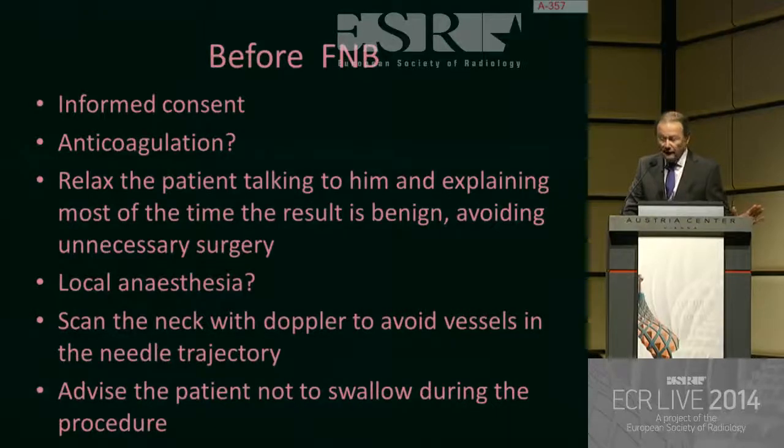It's very important before FNB to get an informed consent. During that process, it's important to explain to the patient the procedure and the possible complications. And in this moment, you relax the patient, talking to him and explaining. Most of the time, the result of the FNB is going to be benign, and that will avoid unnecessary surgery. Anticoagulation, yes. We avoid patients in anticoagulation and consider the procedure like a minor surgical intervention, like a tooth extraction.